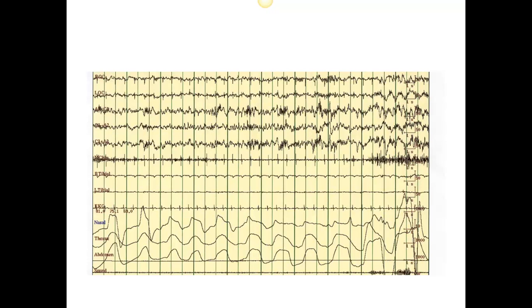Here's an example of stage two. What we see here are these bursts of several, what I'm pointing to on my cursor are sleep spindles. I don't see any definite K complexes within this epoch, but this would be scored N2.